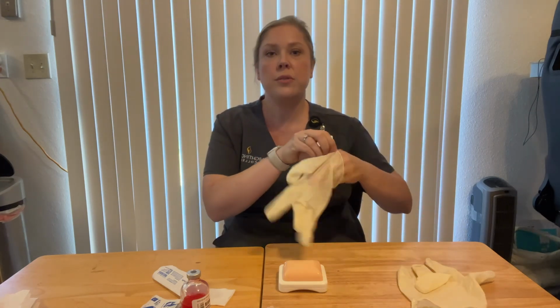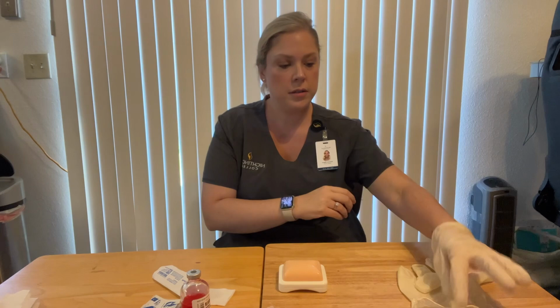Some adverse effects would be dizziness, shortness of breath, and severe abdominal pain. If you do experience any of these adverse effects, please let me know immediately, Mr. Smith. I did also want to mention that you may feel a slight burning or stinging sensation at injection site, which is very common. Do you have any questions, Mr. Smith, before I begin? Okay, perfect. So I'd want to perform hand hygiene. I'd want to apply clean gloves.